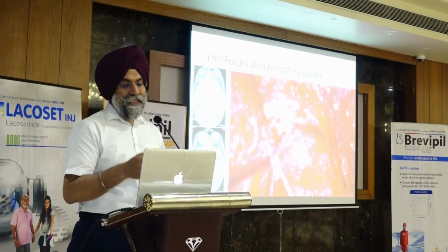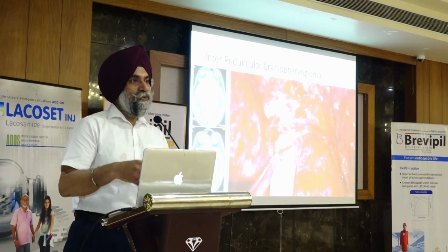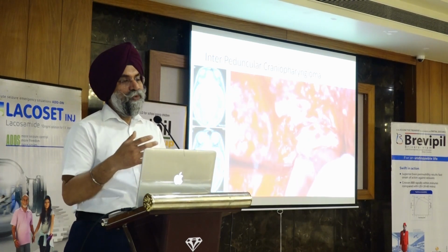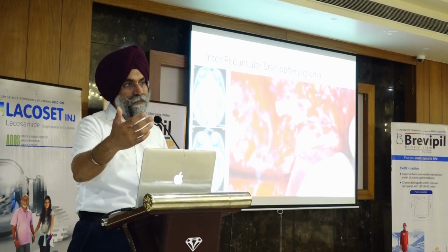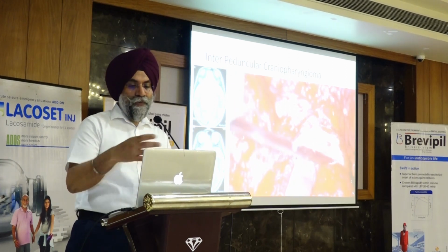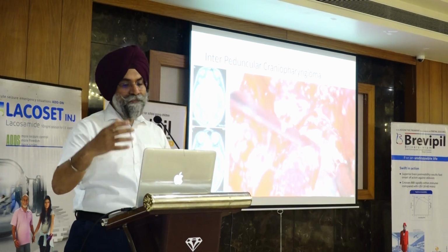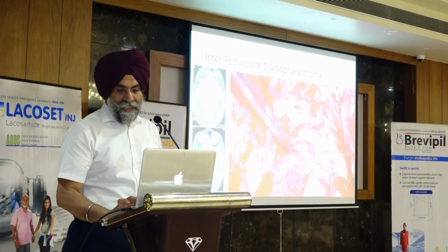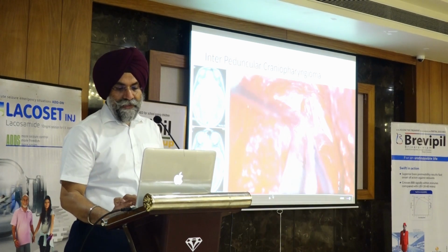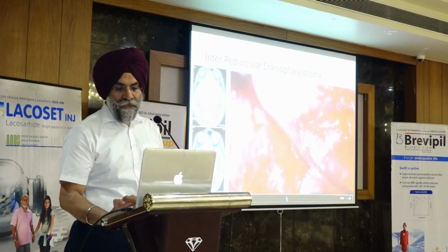For example, in this case, you just lift the whole of the temporal lobe along with its dura of the cavernous sinus, and bring it back more than 5 centimeters from the temporal tip, so that much space is there. Once the CSF is drained and the temporal dura is lifted from the cavernous sinus, a very wide space is there. So once that is achieved, you can have a very good exposure. This is just a dissection of the cavernous sinus, the same way we have done before.